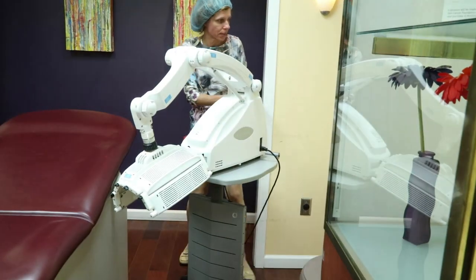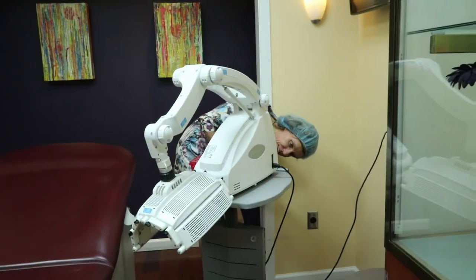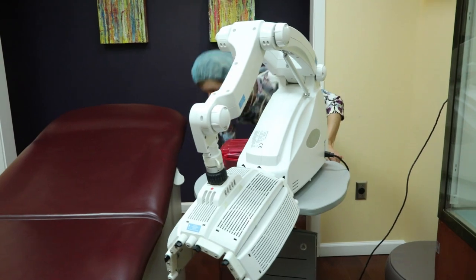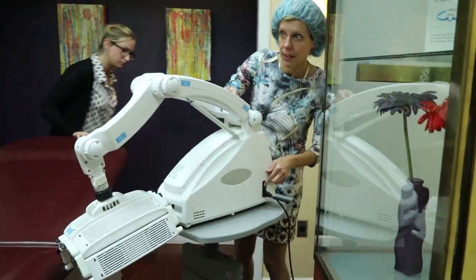While the patient is drying, you're going to be using your machine. The machine is on — the on button is on the side here.